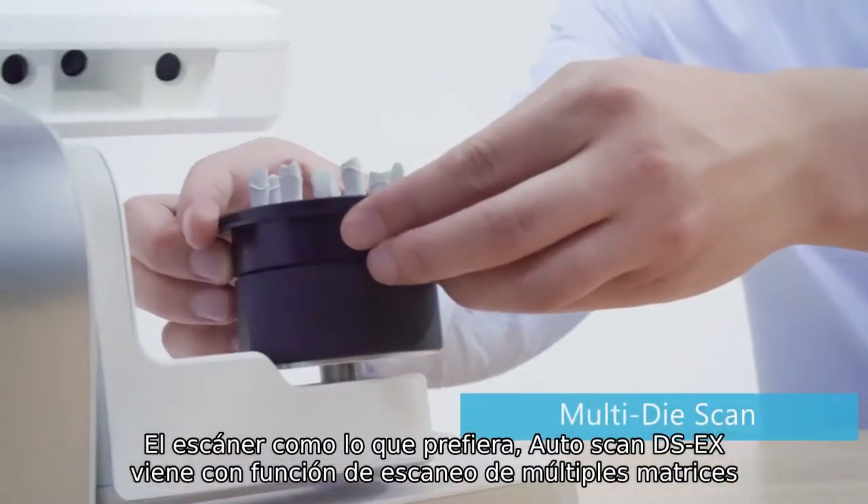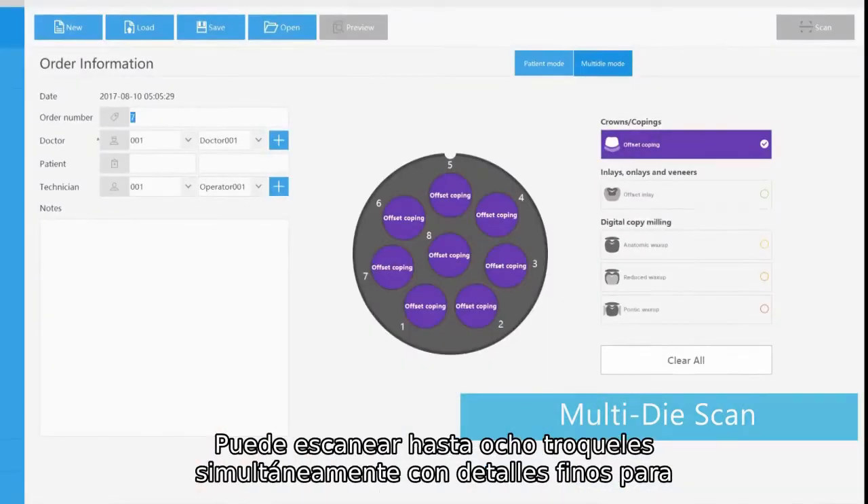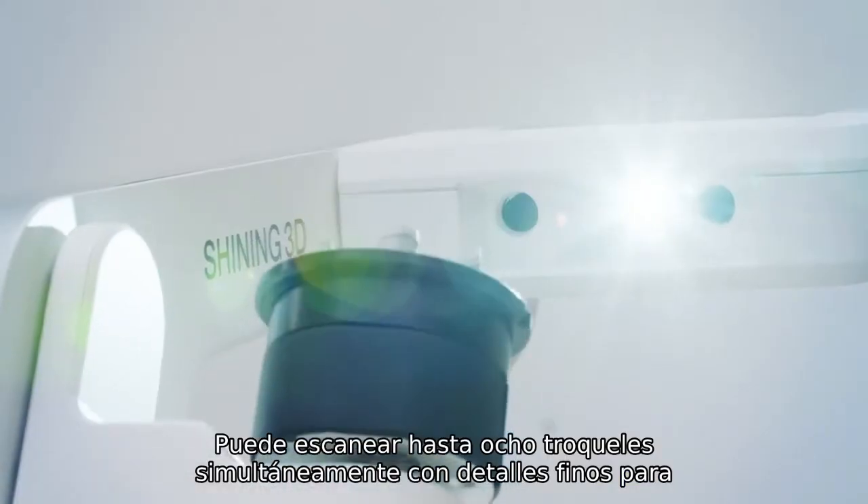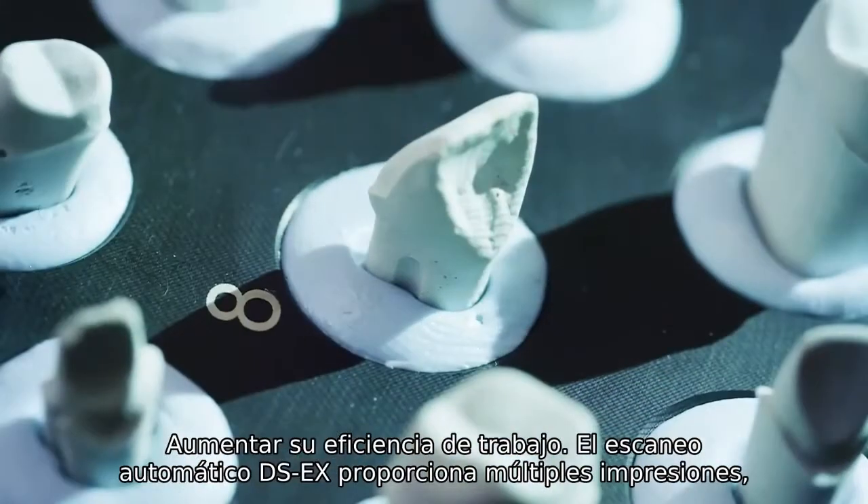Autoscan DS-EX comes with a multi-die scan function. It can scan up to 8 dies simultaneously with fine details to increase your working efficiency.